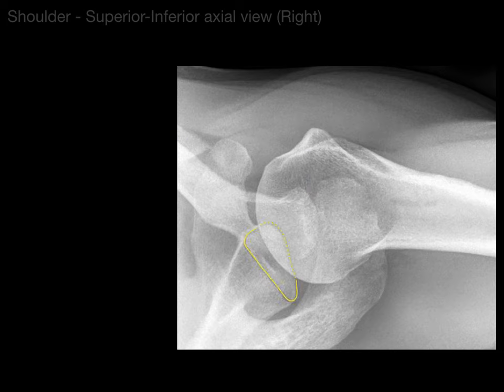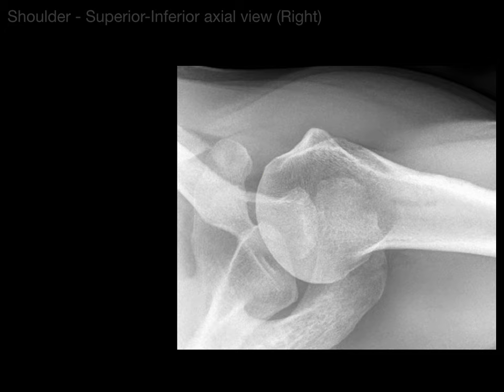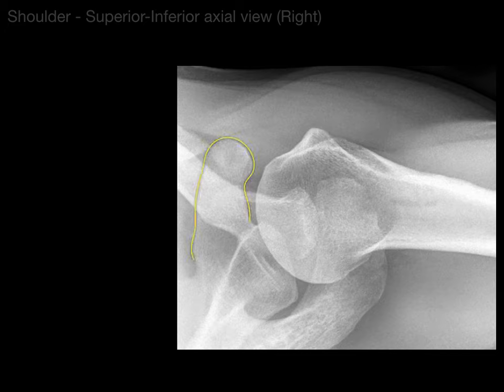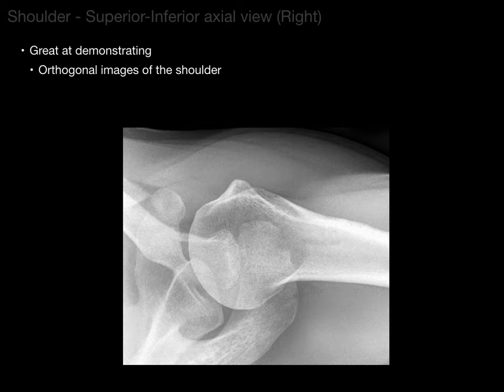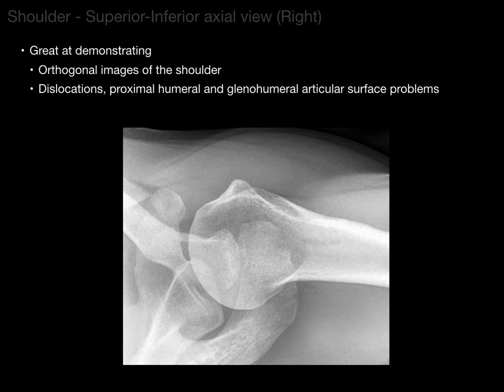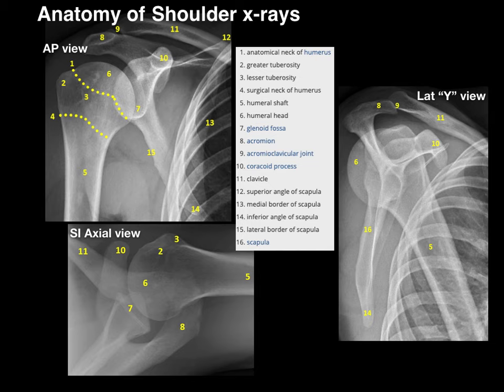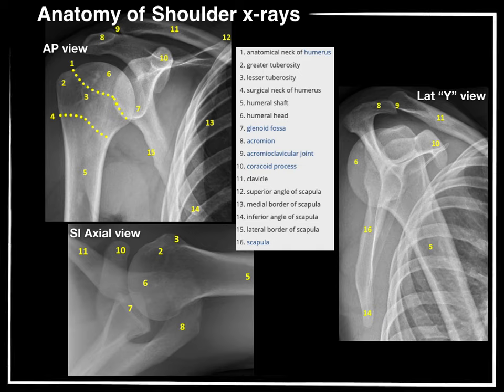In the axial view we also see the glenoid cavity or glenoid fossa — the socket of the ball and socket joint — which articulates with the head of the humerus to form the glenohumeral joint. Coursing anteriorly is the coracoid process of the scapula, and the lesser tubercle of the humerus is also visible. This axial view is great for demonstrating orthogonal images of the shoulder at right angles to the AP view, and is useful for assessing dislocations and glenohumeral articular surface problems. And that, my friends, is the anatomy of the shoulder through x-rays — in a nutshell.